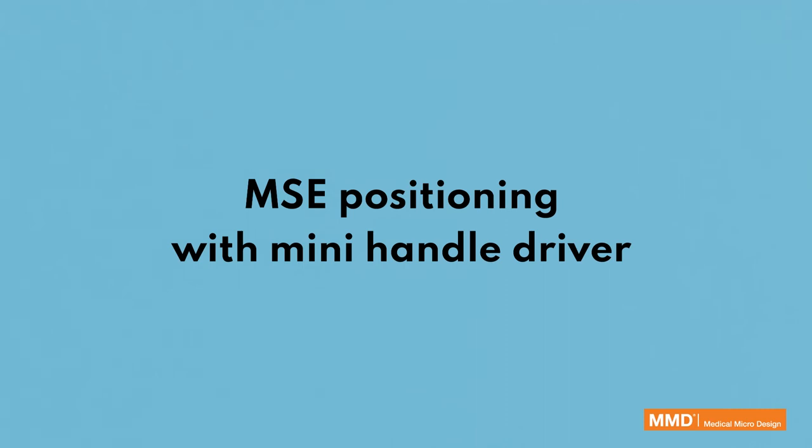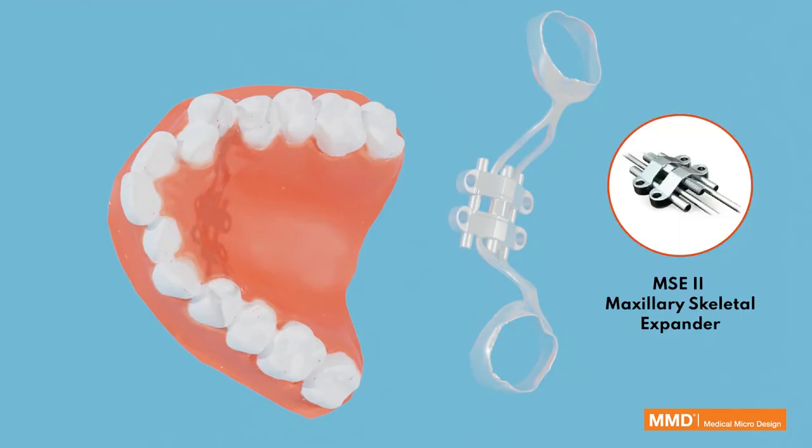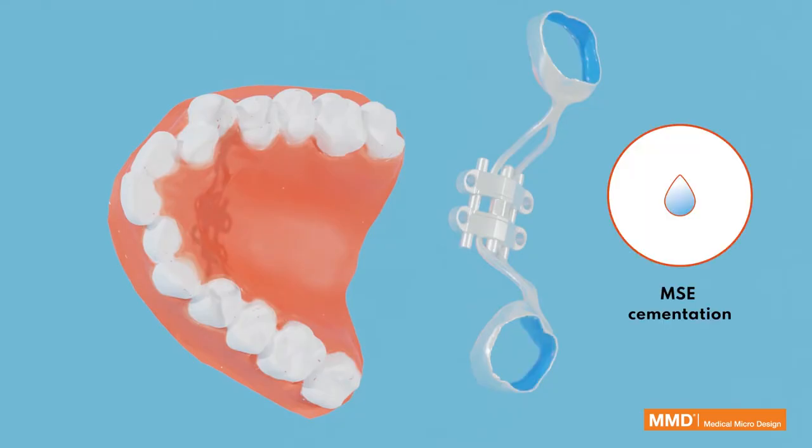MSE positioning with mini-handle driver. MSE 2 maxillary skeletal expander cementation.